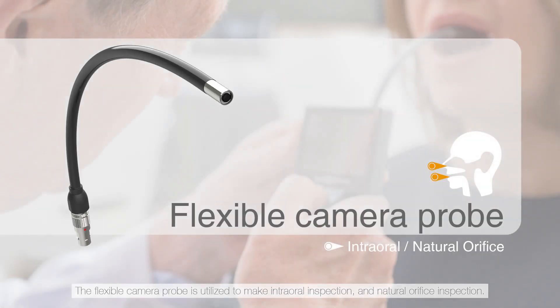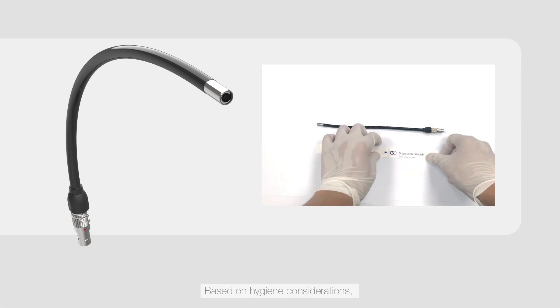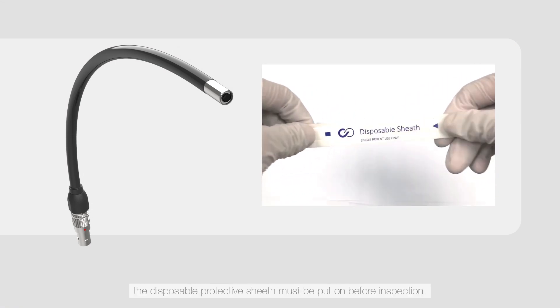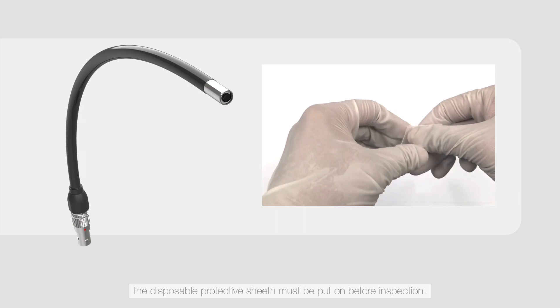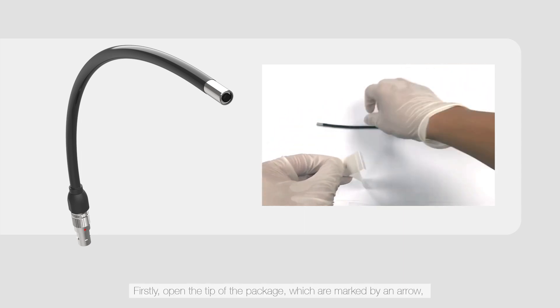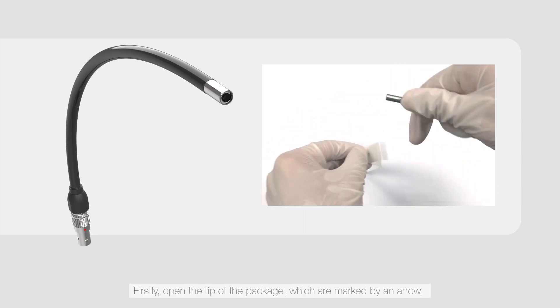The flexible camera probe is utilized to make intraoral inspection and natural orifice inspection. Based on hygiene considerations, the disposable protective sheath must be put on before inspection. Firstly, open the tip of the package which is marked by an arrow, and an opening of the sheath will be exposed.